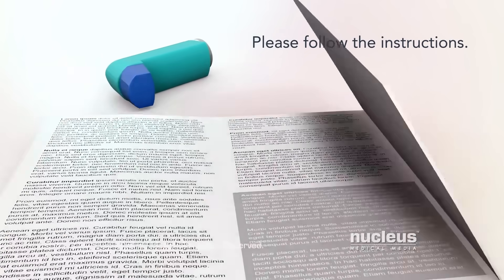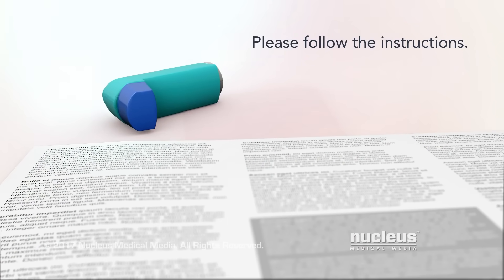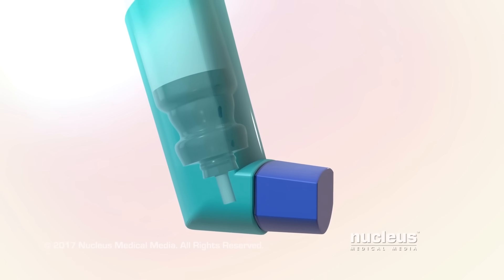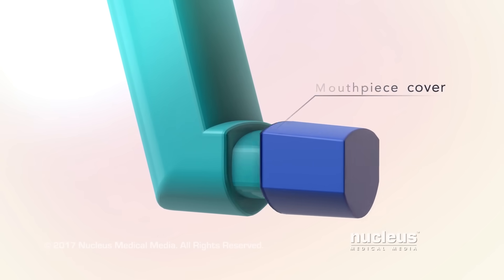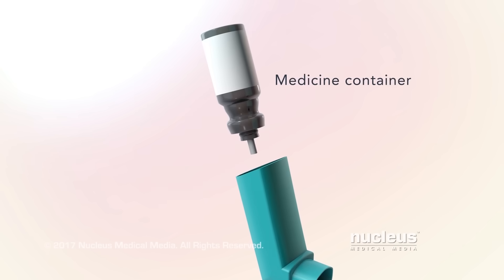It's important to follow the instructions that came with your metered dose inhaler. A metered dose inhaler has three main parts: the mouthpiece cover, the plastic sleeve with a mouthpiece, and the medicine container.